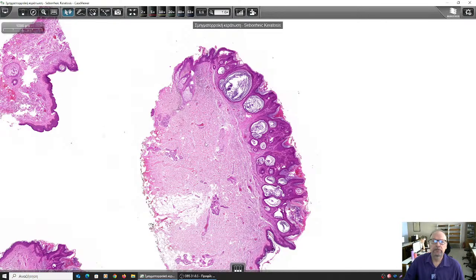Below means here, below the level. That would be an endophytic. Yes, but have a look where the level of the normal epidermis is. You see the normal? So this is normal. It's not here. That would be an endophytic pattern. You see? What's the problem? It grows up. What's happening?